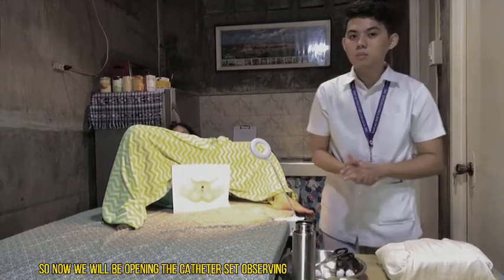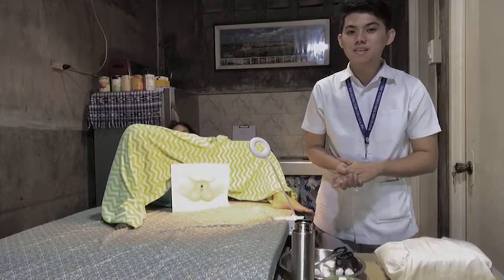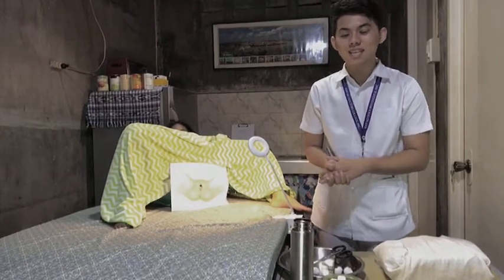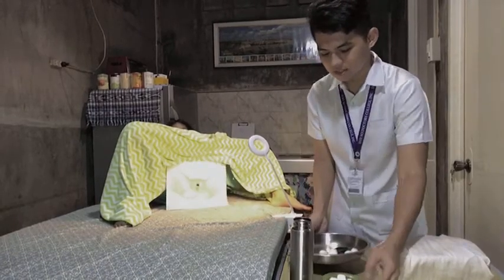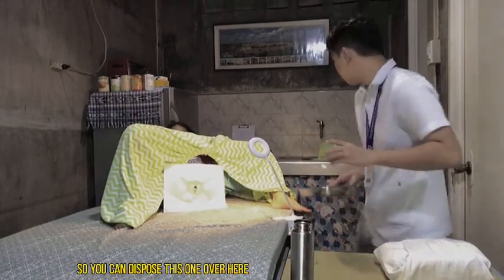So now we will be opening the catheter set, observing sterile technique for us to maintain the sterility of the materials. So you can dispose this one out here.